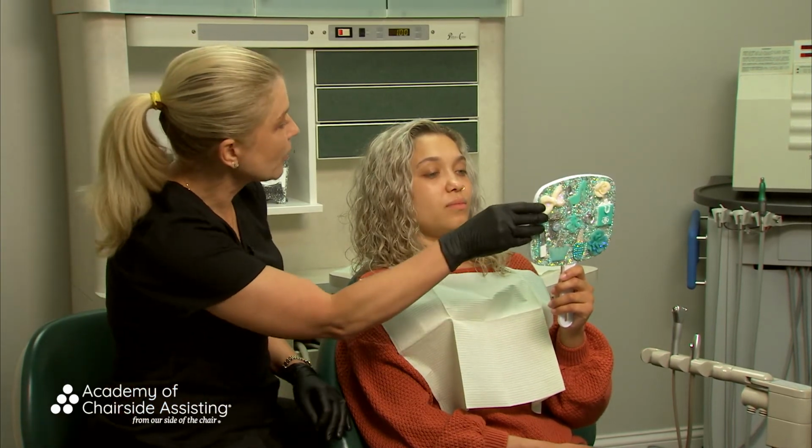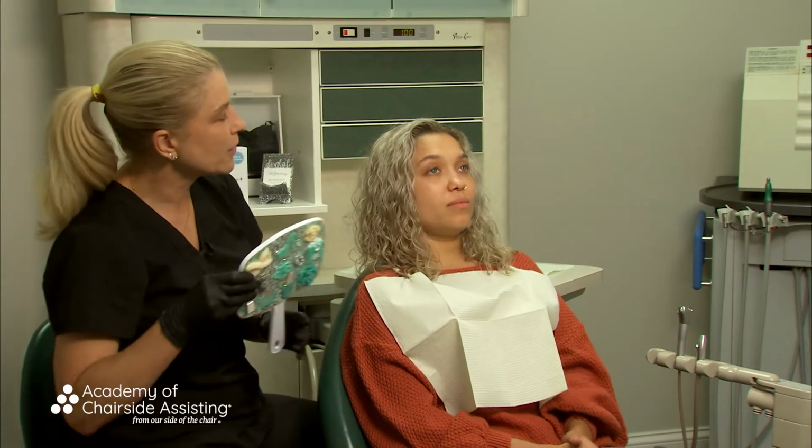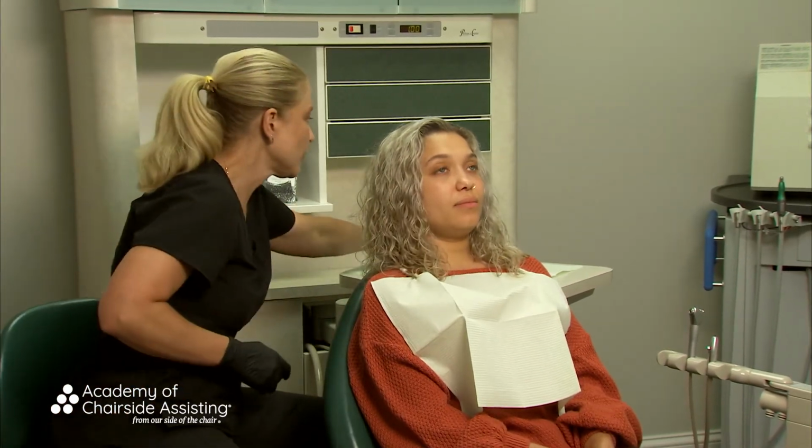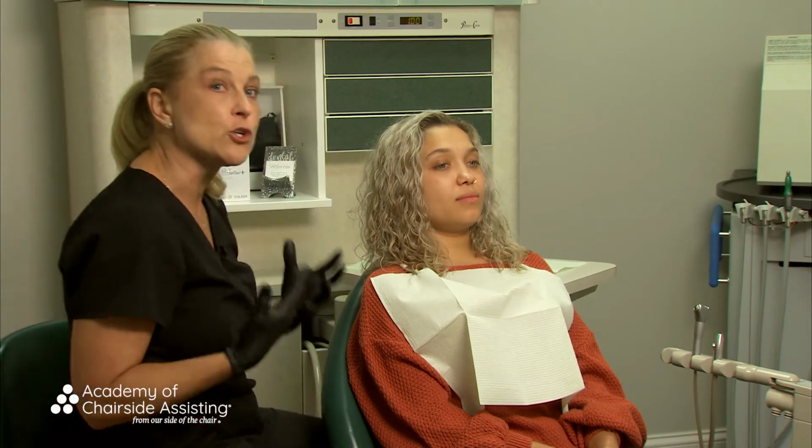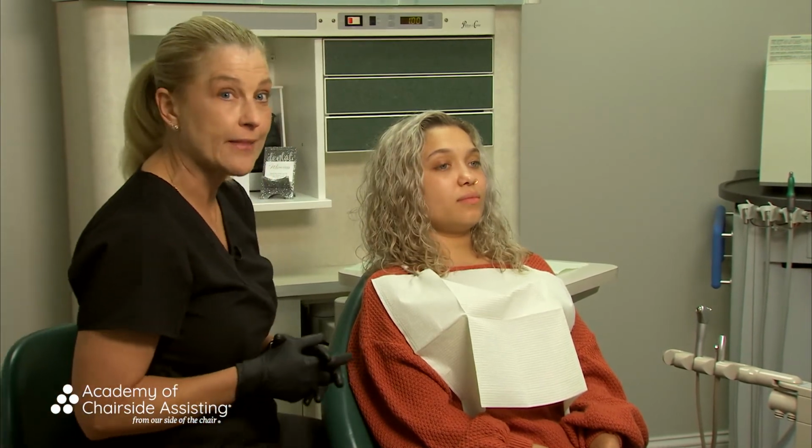So I'm going to take this from you, Haley, and what I want to do is just kind of go through just a few other little tips here, just so this way the dental team will know some things that you could say to patients to make sure that we have that compliance. So while Haley is getting her teeth lighter and we're waiting here for the full 20 minutes, I want to give a couple of tips, again, making sure that you understand exactly the things that we need to be saying to patients.